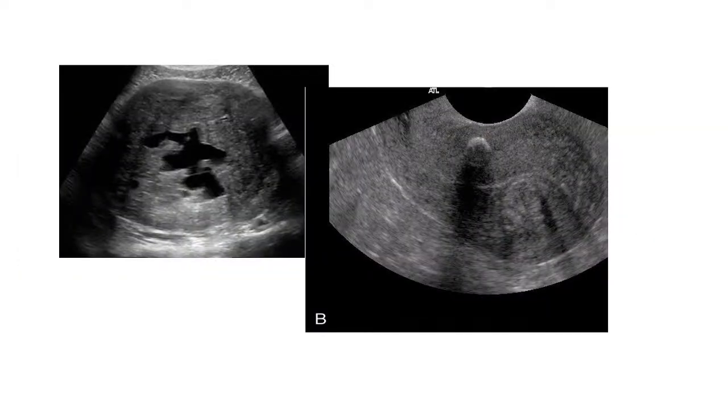So here you have a unique type of fibroid. What we have here is a fibroid, again appearing like the head of a fetus, but interestingly inside you can see that there are cystic spaces, there's some fluid collection. So this is what we now call a degenerating fibroid. When a fibroid does not have enough blood supply, part of the central spaces or part of the fibroid starts to undergo infarction. So this is an infarction.